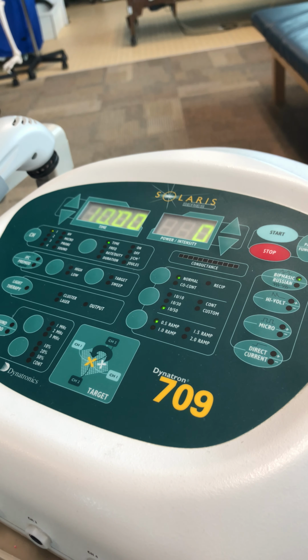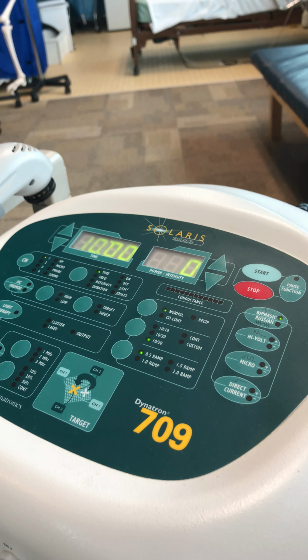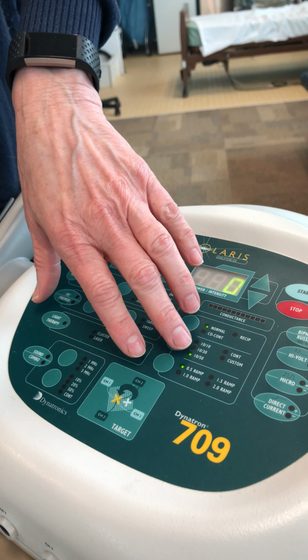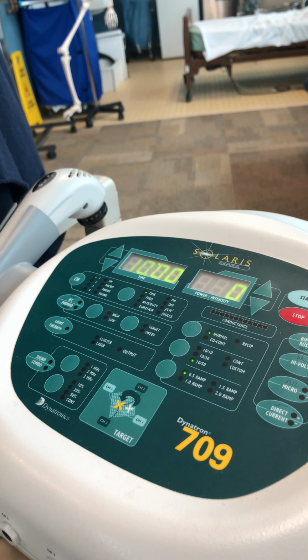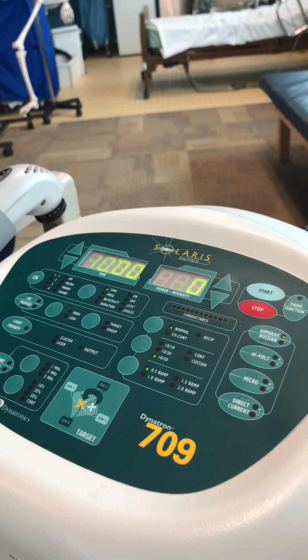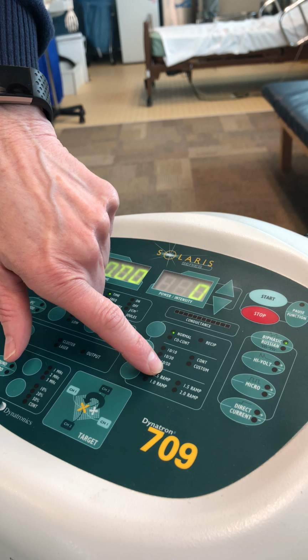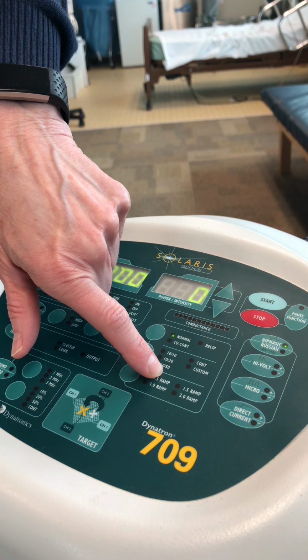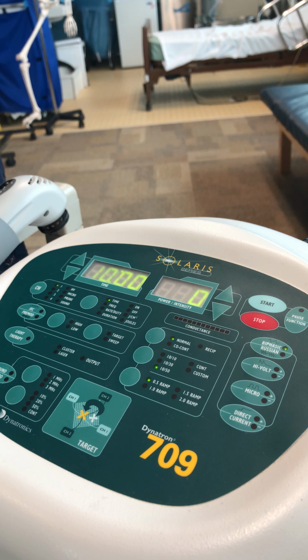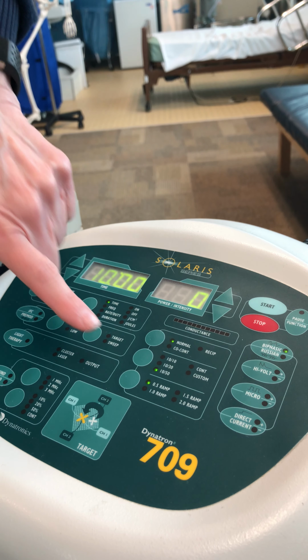If you're using this to get increased strength, and someone's weak, we usually start with 10-50, so it's a longer relaxation time. If someone, for instance, has a weak quad and you don't give enough relaxation, you overstimulate them, they're going to get up and their quad's going to give out and they're going to fall, and if they get hurt, you're going to be in trouble for it. So we're going to start with 10-50.